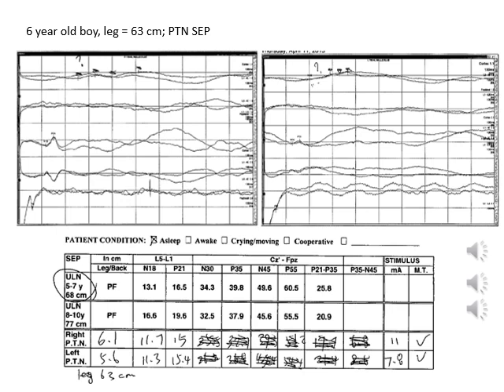Looking at the tracings, again, they're clean and reproducible. And I'd like to point at the lumbar responses on the left leg. They're really beautiful. And so it's very clear to see the phase reversal where the positive going peak in the middle tracing is the P21, and it phase reverses with the next tracing below it. And we also see a fairly clear peripheral response in the record.